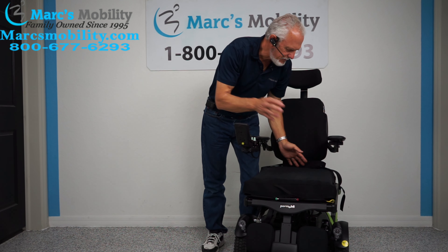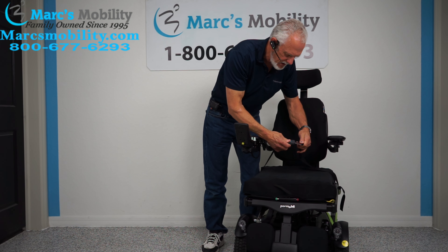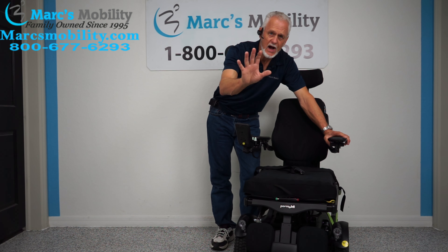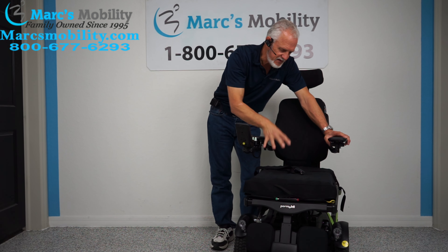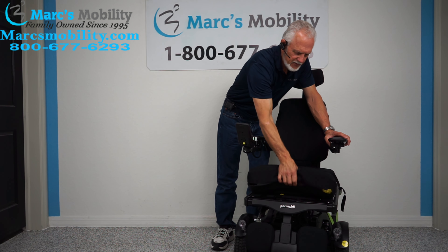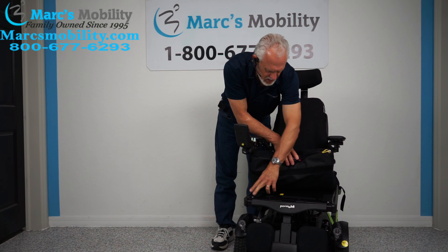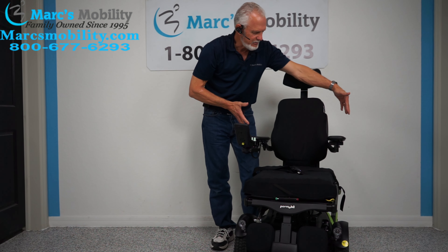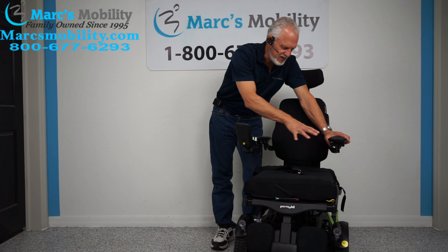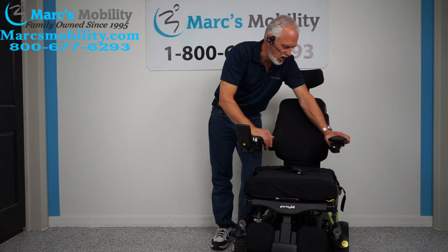The seat on the chair is 18 by 18 and it does have a safety belt. We can fully customize these chairs to your height and body. If this seat is too big or too small, we can change the cushion — they come right off. We can make the pans larger, make the back bigger or taller. If this is the chair you want, don't let the size of the seat deter you because we can customize those at no extra cost.